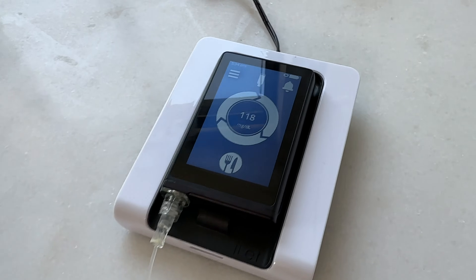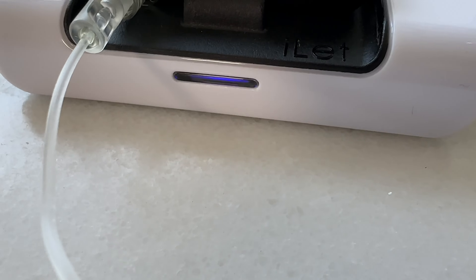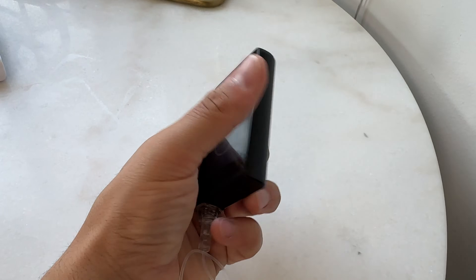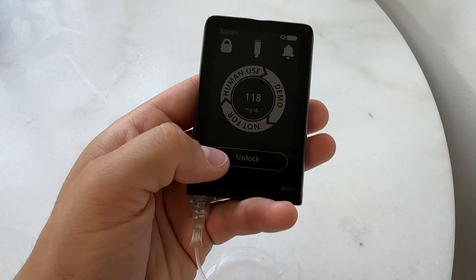I put it on there, the device starts charging, and this light turns blue letting you know it's charging. The device still doses insulin while it's charging. From what I was told, it charges at about 1% per minute. The device has no openings for charging or anything, because it is water-resistant and dust-resistant — almost waterproof — although they recommend you don't go swimming or shower with it. You just leave it out while you're in the shower.